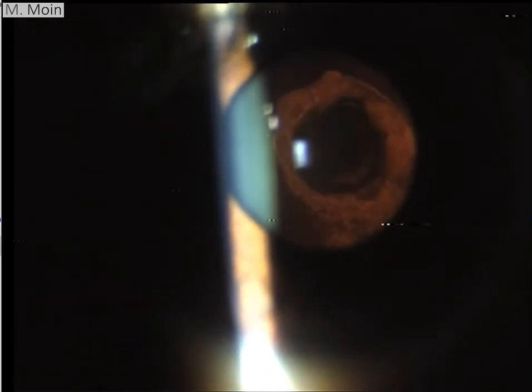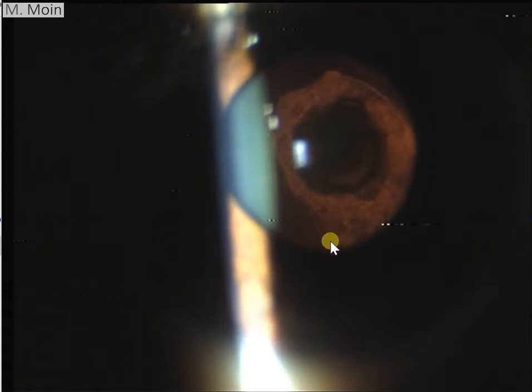But red reflex is actually which gives you a great view of this. This is the posterior subcapsular opacity which you're seeing around it and this is the ring shaped or the onion peel or the bullseye appearance of a posterior polar cataract.